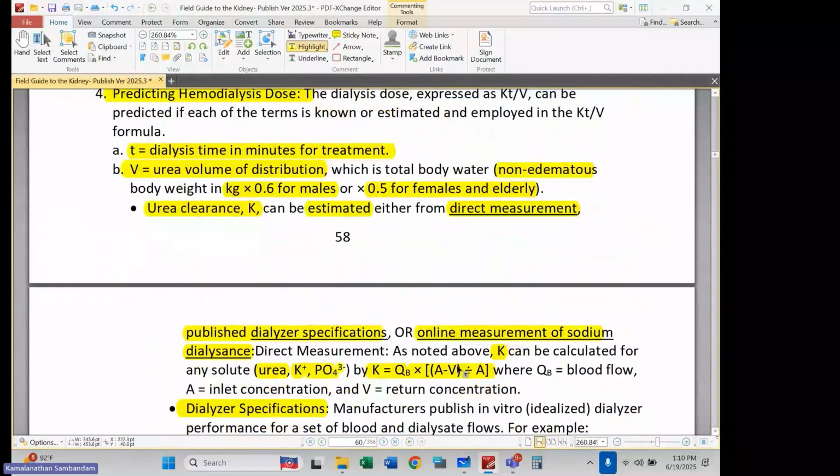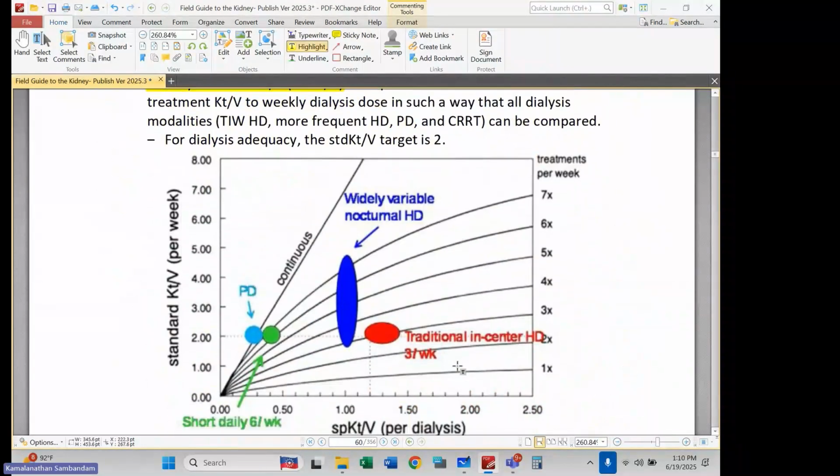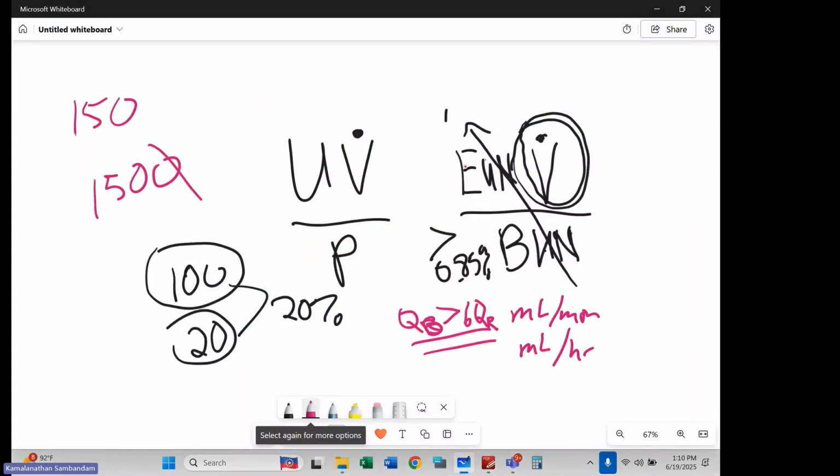We talked about that in our discussion around intermittent dialysis as a way to compare clearance with continuous CRRT, right? We've already explained how you can calculate a clearance with CRRT.